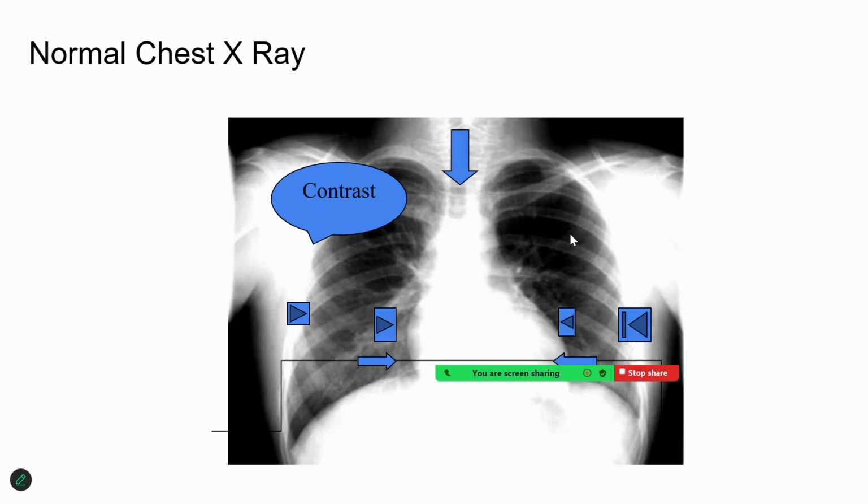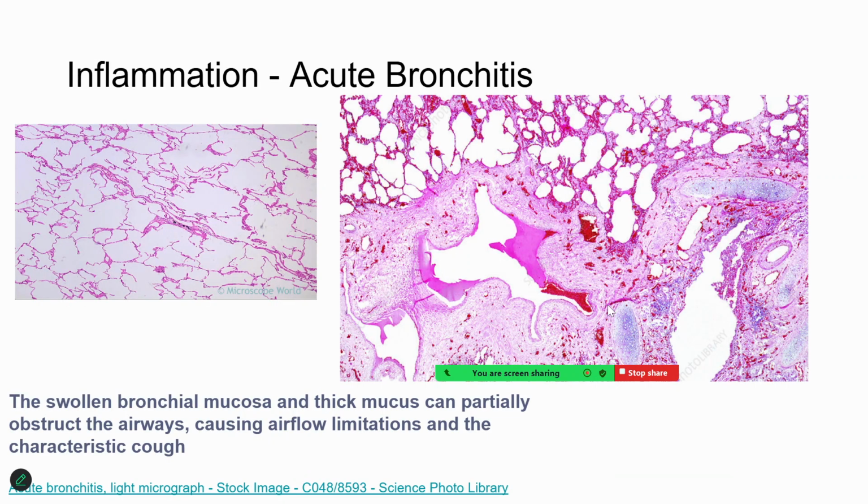The breast shadows of the female would also mask the shadow, and hence these also have to be identified. That's about the basic issue. Now I will not waste more time on that basic issue. We'll directly go into the diseases of the respiratory system.